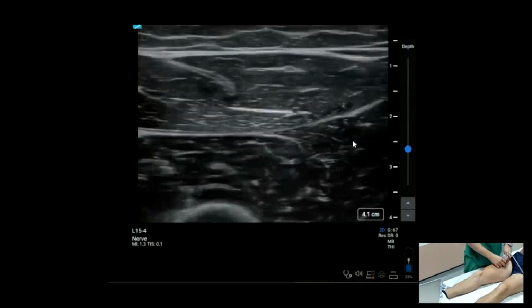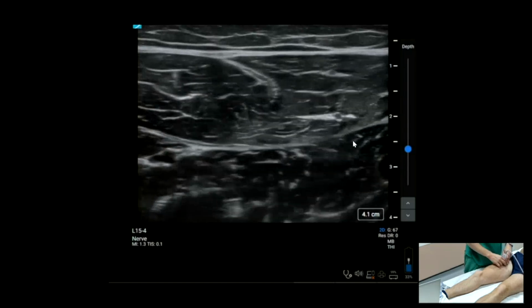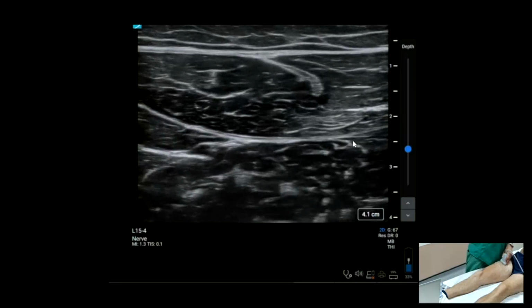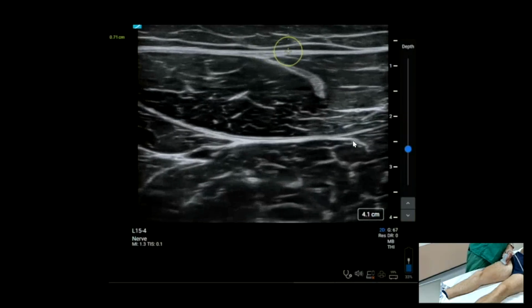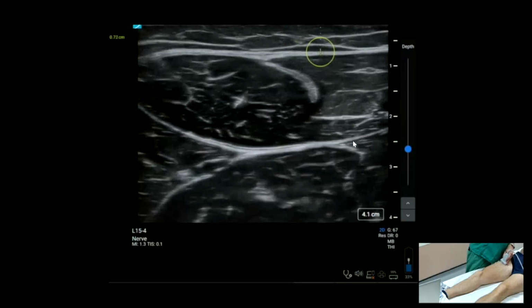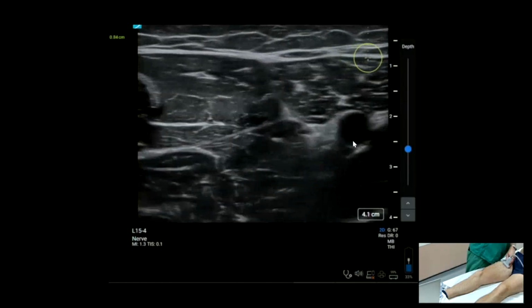So this is sartorius, this is rectus femoris, with vastus intermedius underneath. And there's also normally one over the top of rectus femoris as well, which would be somewhere in the zone up here. So you see, this is normally a plane, a sort of fatty plane here. And you see in Max, it's just a layer of fascia. There's just no space in there at all.